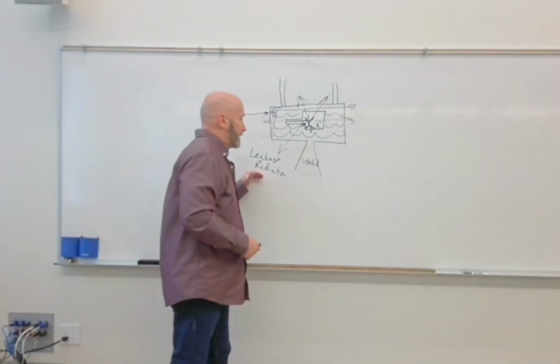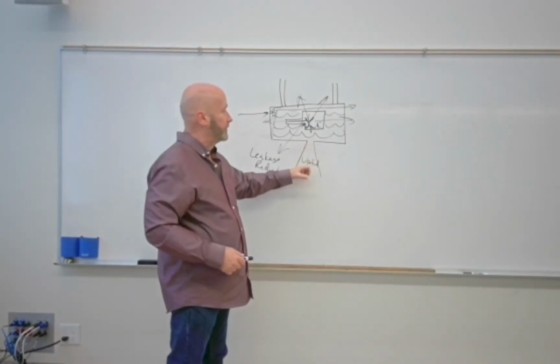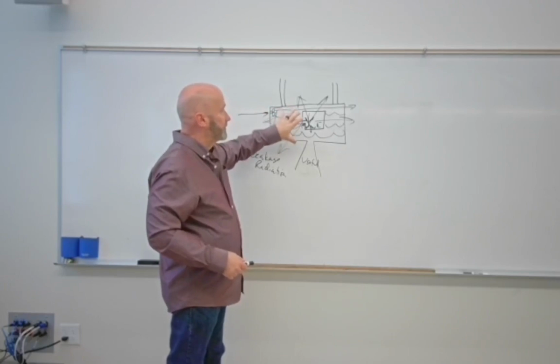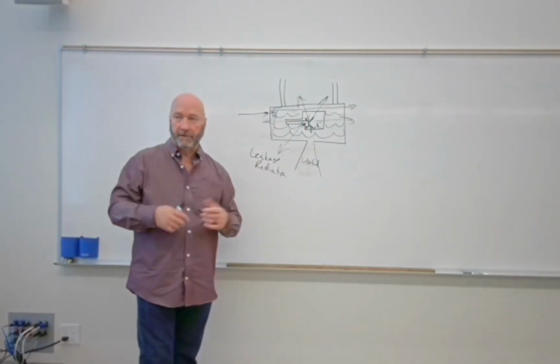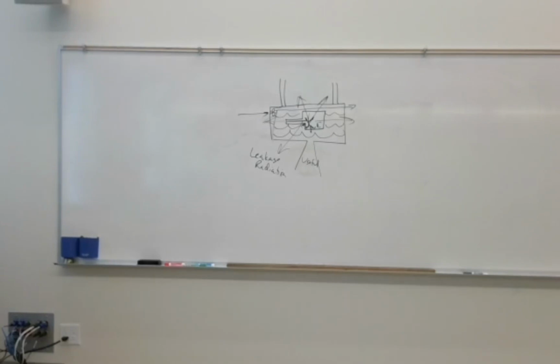All right, so it limits leakage radiation. It limits the X-rays to the useful beam through the port. Inside the protective housing, you've got all this stuff to help cool it, but also the oil helps not just with the heat, but also as an electric insulator. So it does a lot of stuff. It protects you against the X-ray tube, but also protects the X-ray tube against you. Let me make sure I didn't miss anything I wanted to cover. And I did not. All right.